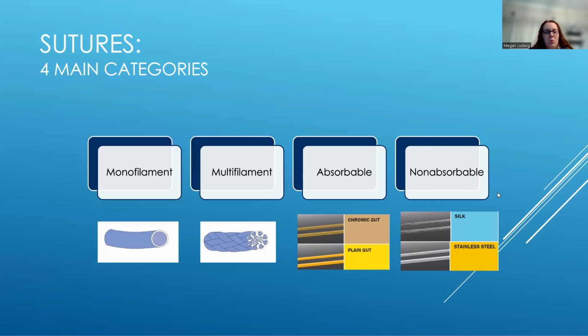Or they're non-absorbable, in that they should theoretically just stay in the body forever. What the body typically will do is like build tissue around it and wall it off. Okay. So it'll just be there. Sometimes if it's close to the skin, you might have suture that works its way out and you can sometimes pick it out. That happened to my dad.